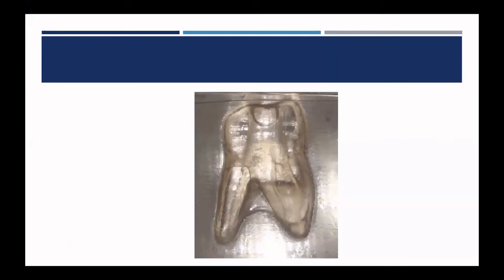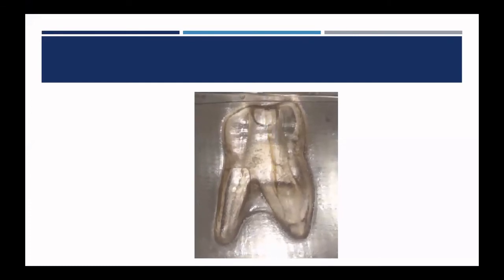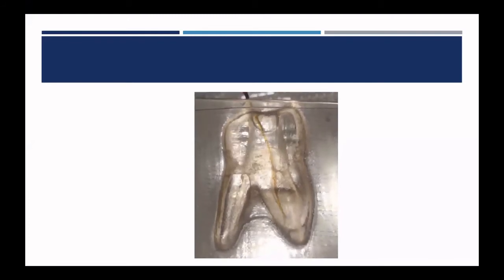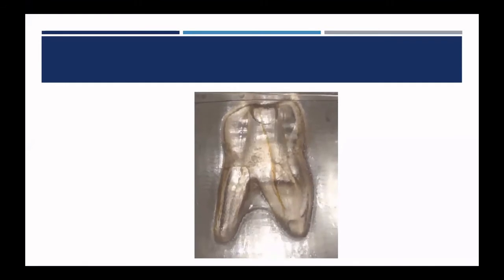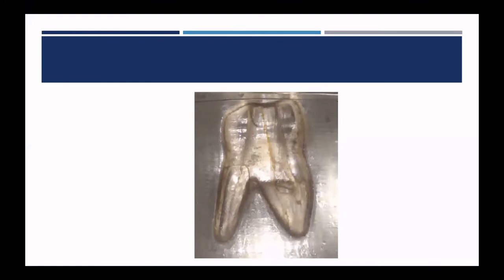Let's look at a little in vitro study — a replica printed by Dr. Buchanan. We're going to look at the cavitation and fluid dynamics of the laser. We're looking at the MB root — the fiber is in the MB2 — and we're going to activate it. You're going to see the fluid dynamics occurring as we withdraw the laser tip. There's a little anastomosis between the MB1 and MB2 — if you look closely, you'll see cavitation bubbles crossing over and cleaning out the isthmus and anastomosis between the canals.